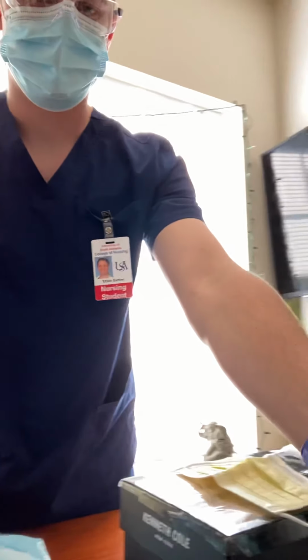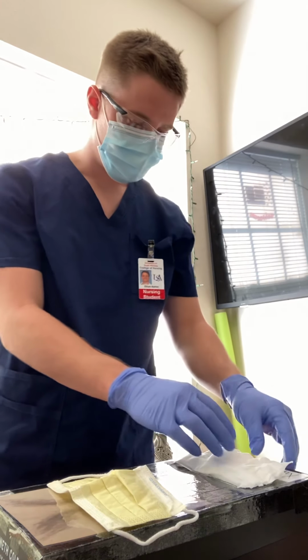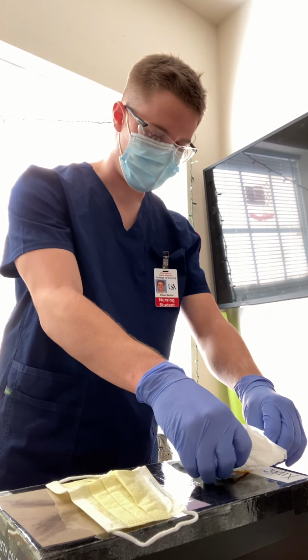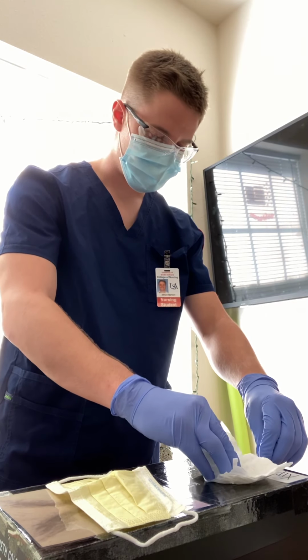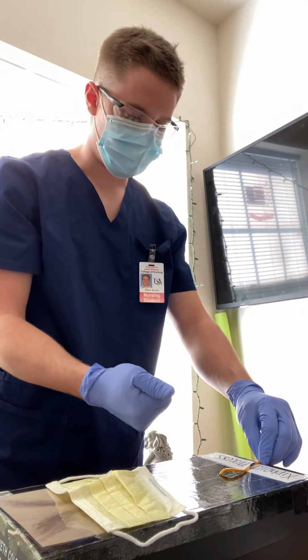Now I'm going to turn the camera where you can see again, and I am going to move this so you can see. Stabilize the catheter with my left hand, and then pull away towards the injection site while removing the Tegaderm. Make sure that the Biopatch is removed with the dressing. I'm going to crumple that in my hand, and then I'm going to assess this site.